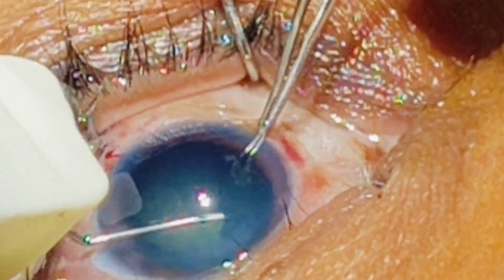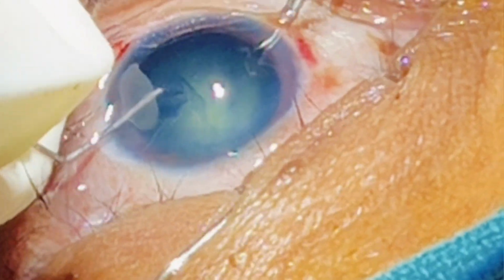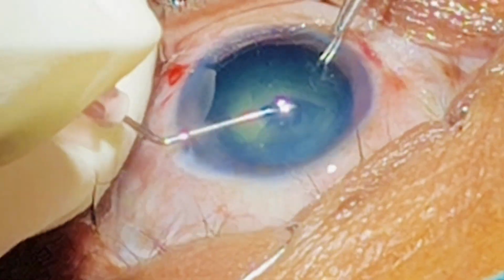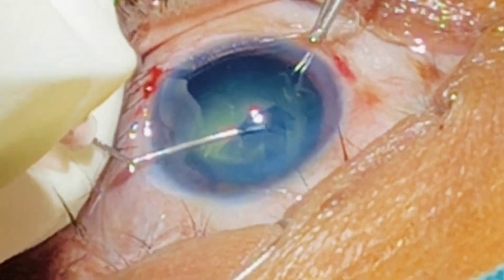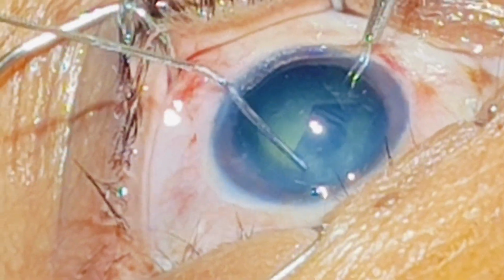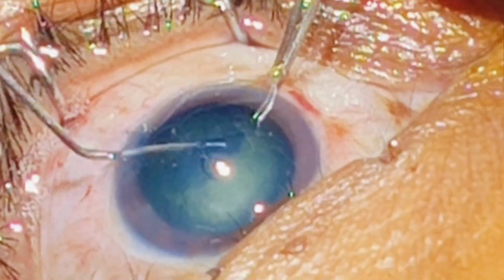Now I am, with the help of a cystitome, doing the capsulorhexis, and here the capsulorhexis is almost around 5 mm. I usually do a 5 mm capsulorhexis, not larger, not smaller, because a smaller one will definitely cause capsular phimosis syndrome, and a larger one will have many other disadvantages, like the nuclear fragments will slip out of the capsular bag, and the PCIOL will not be well centered.